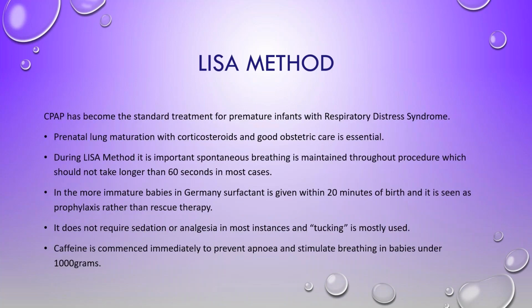So CPAP has become the standard treatment for premature infants with respiratory distress. And this has saved many, many lives in the lower income countries, because a foundation like the Bill and Melinda Gates Foundation, who supported the development of Seattle PAP, has made it affordable for these babies to receive CPAP.